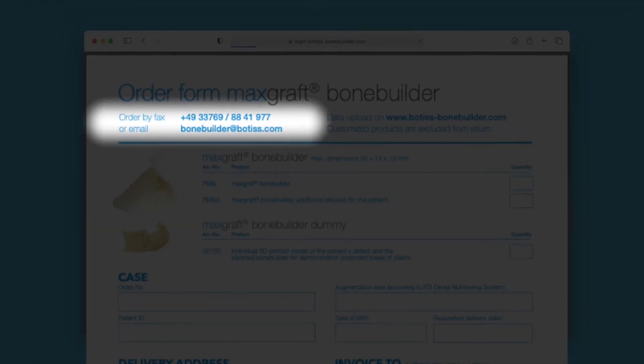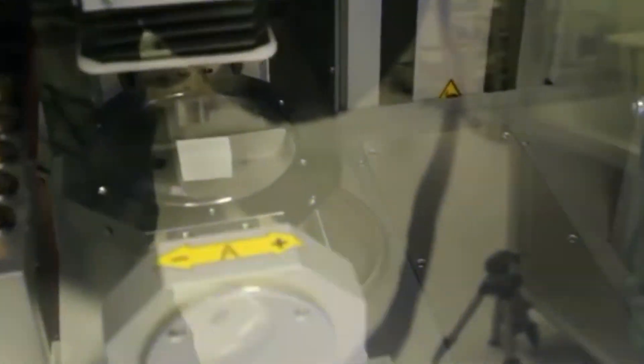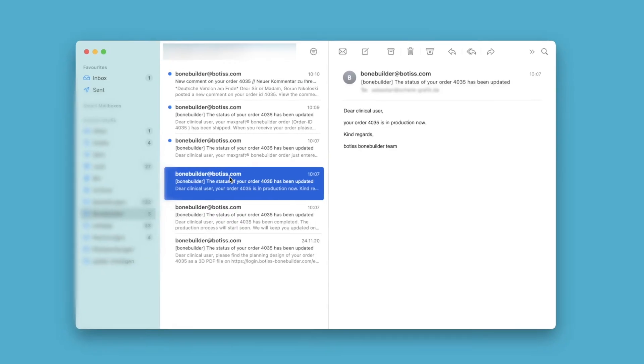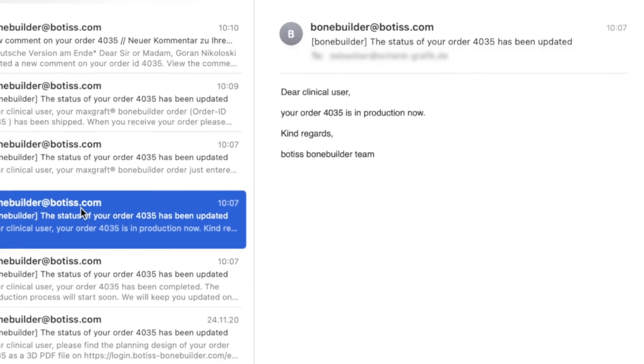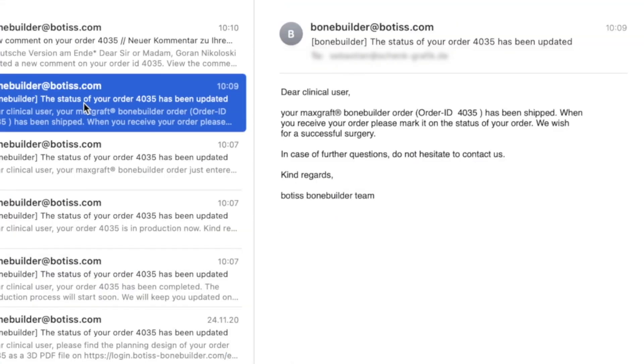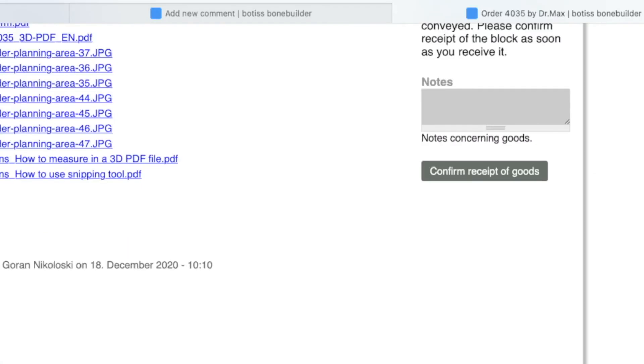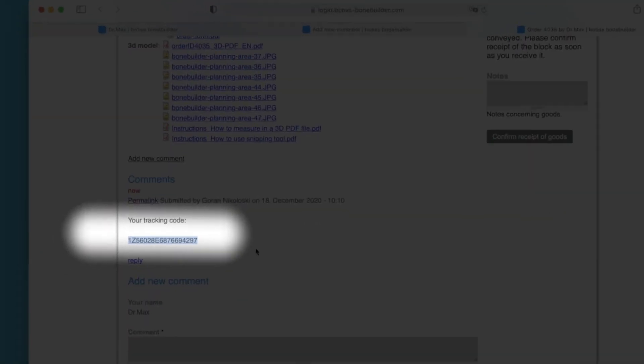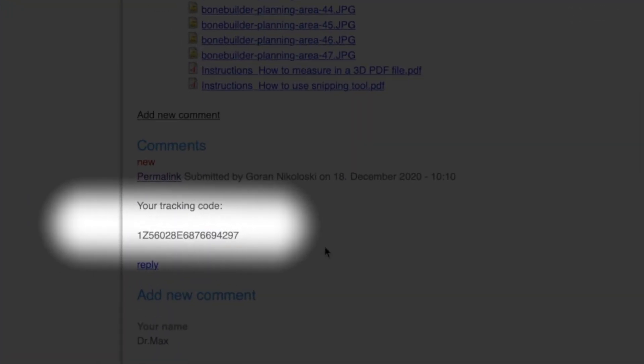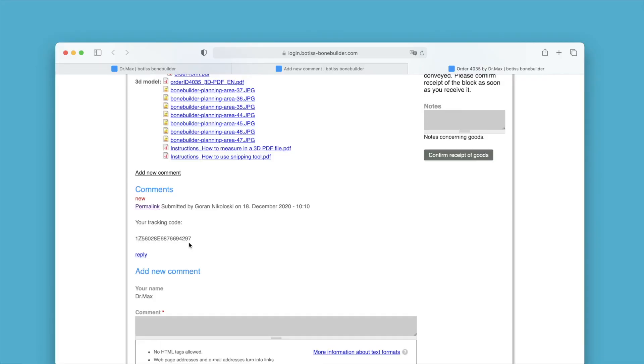We will now start production. You will be kept informed about your order status by email. You will receive the tracking number of the shipping partner so that you can track and plan the delivery.